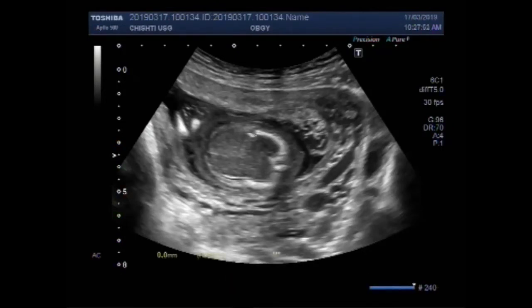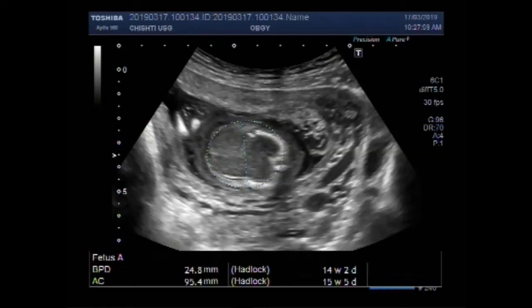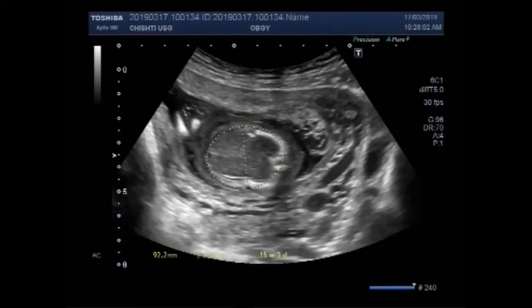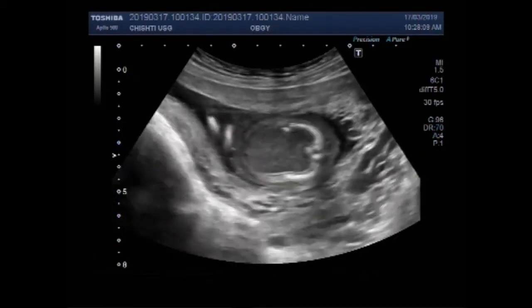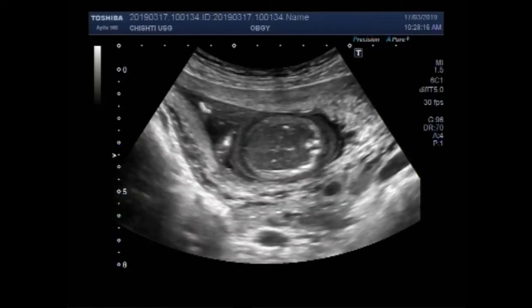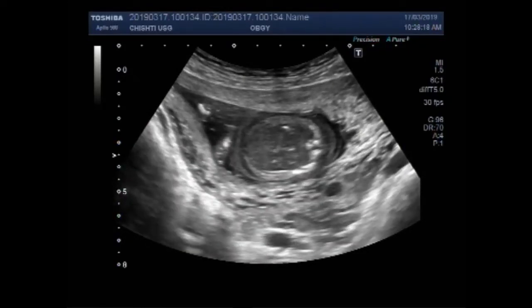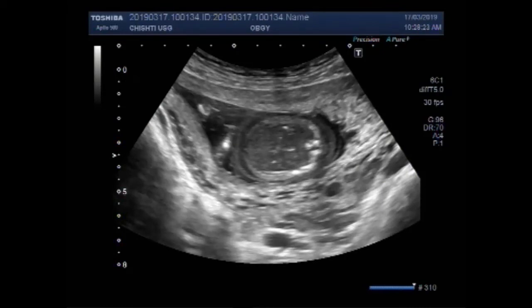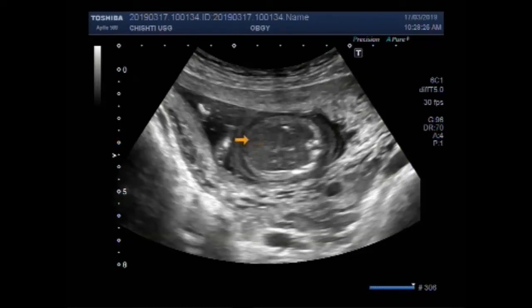Pregnancy measures about 14.2 weeks with BPD, and with the fetal abdominal circumference it measures about 15 weeks. There is no cardiac activity seen in the fetal heart.